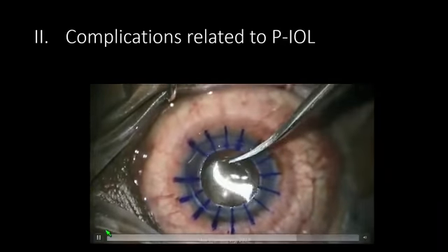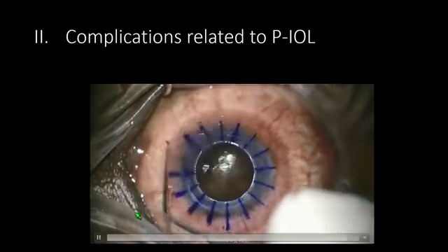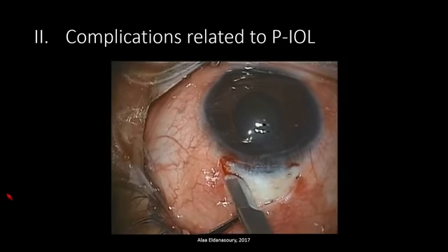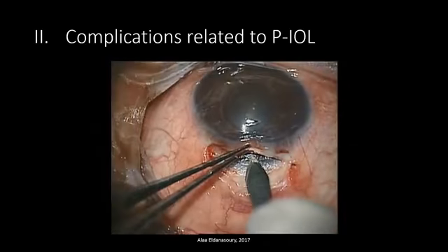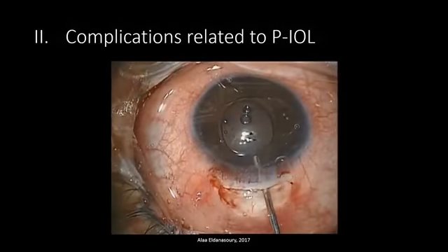But I'm facing these kind of cases with the angle-supported lenses that come many years later with corneal decompensation, and the only way is to do a graft on these patients. Now, with iris-supported lenses, corneal decompensation can still occur if you do not respect the critical distance, which has to be 3 millimeters or more from the endothelium.